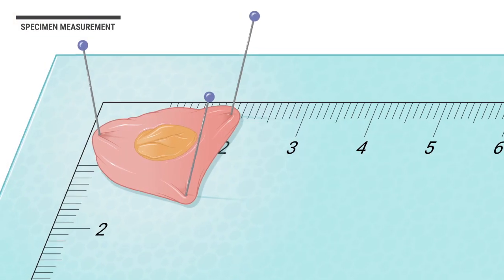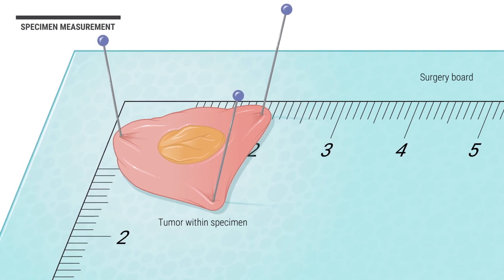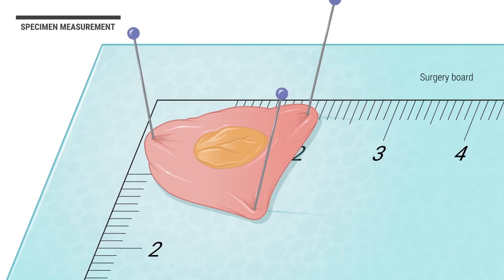After which the tissue or specimen is pinned and measured on a surgery board, collecting essential data about the specimen, and the specimen is then sent to the pathology lab for analysis.